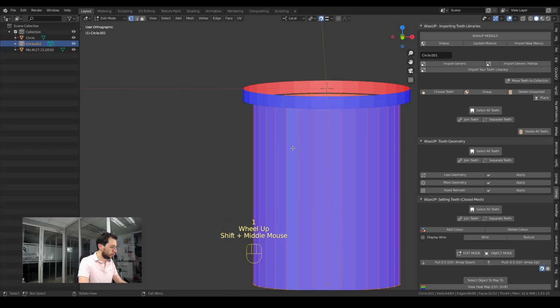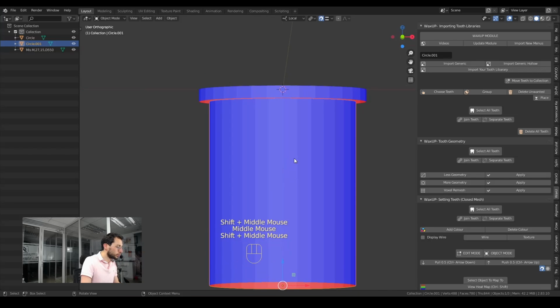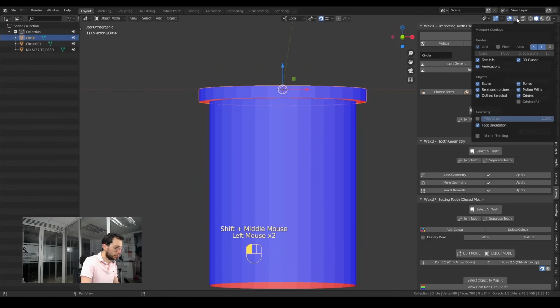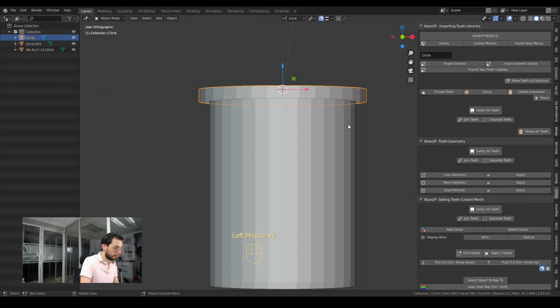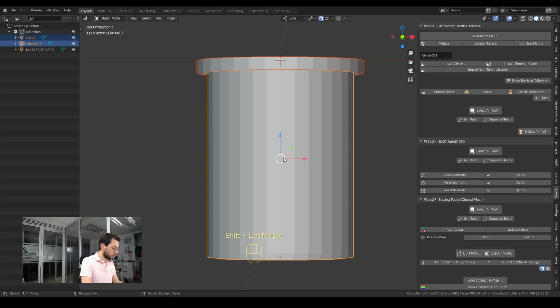Okay, I go out of edit mode, and now I need to combine both things and close everything, okay? In order to do it, I click this one. I will change my face orientation option again. Remember, it's in here. I select this one, Shift and click, select this one, Control and J to join both.